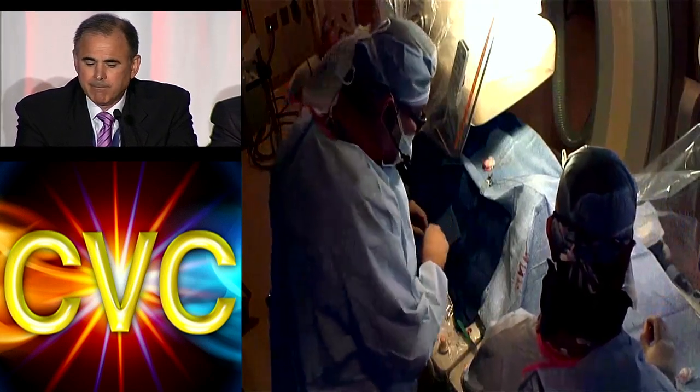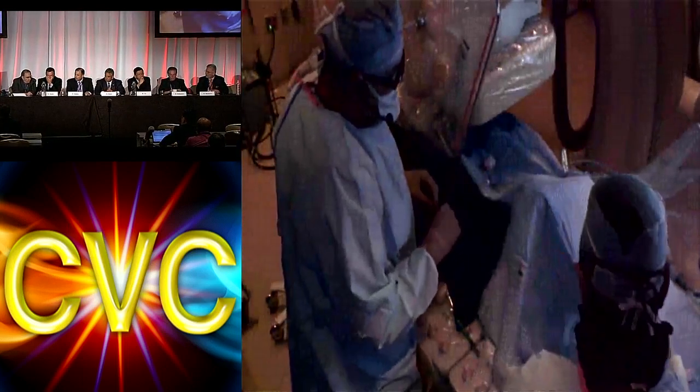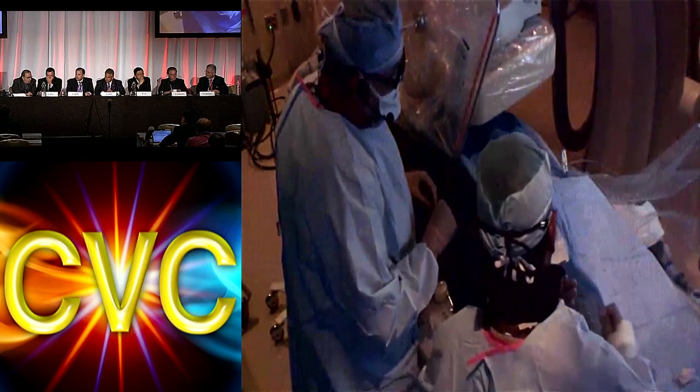Yeah, that's exactly what this felt like a second ago. Would any of you use a glide wire down there? 035?